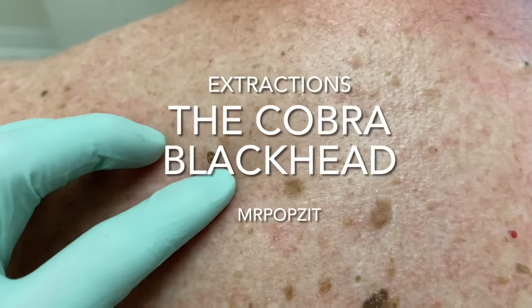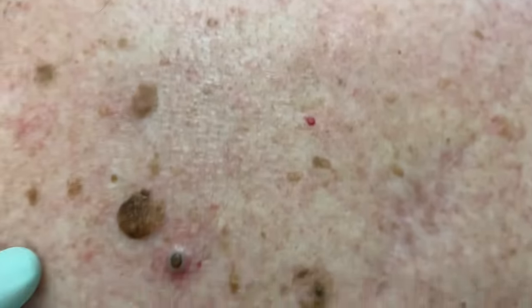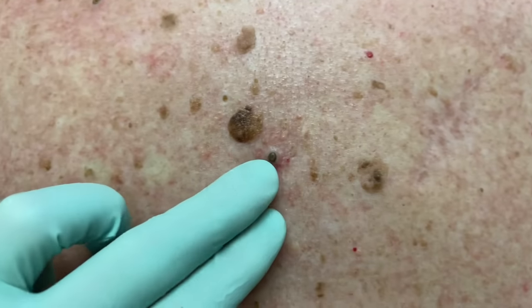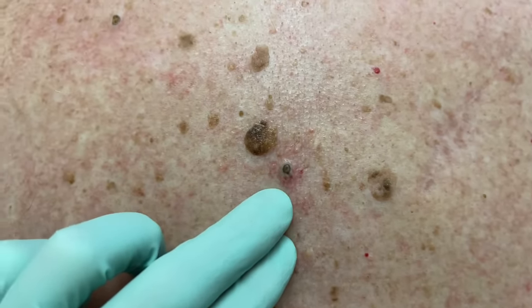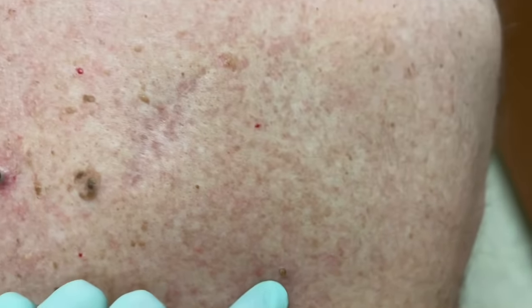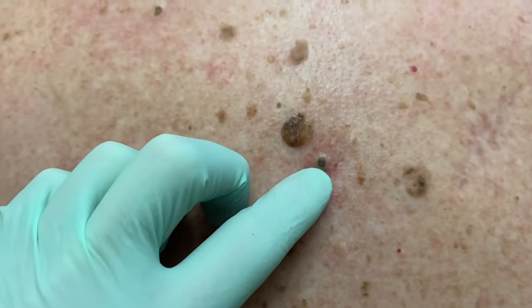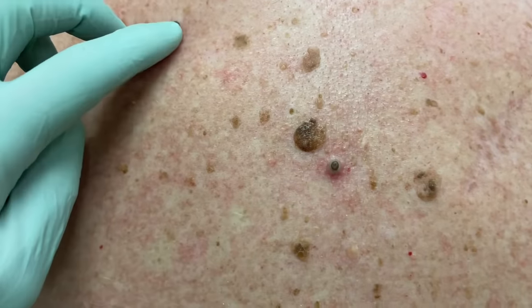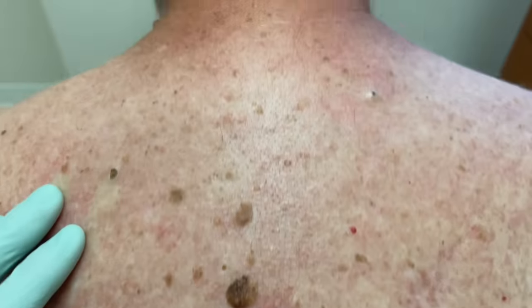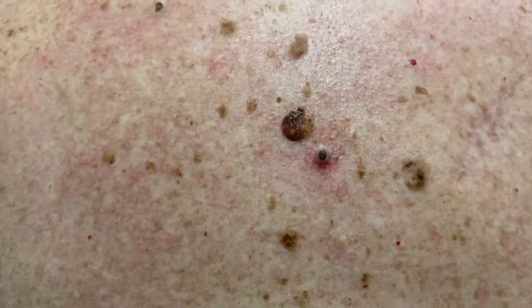We have multiple blackheads here and dilated pores of Winer. These enlarged pores fill with dead skin and oil sebum and cause these little plugs. Those can turn into bigger cysts if we don't get them out. You can see that oxidization — they kind of turn darker when they hit oxygen, so at the top they'll be dark and then there'll be some yellow contents underneath.